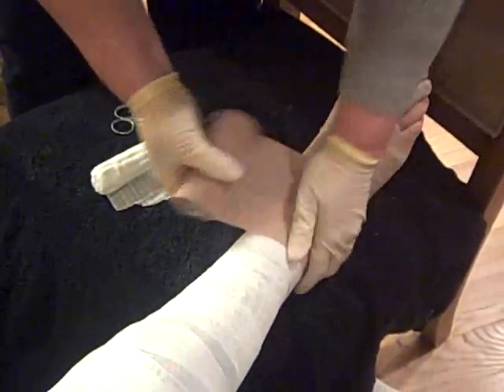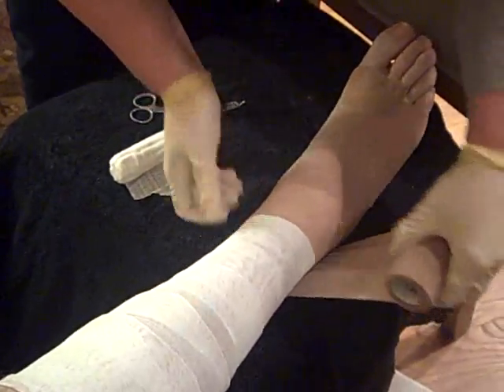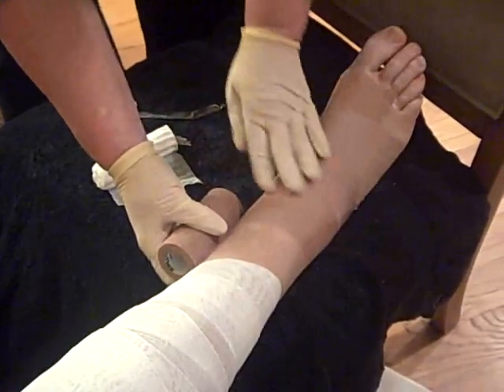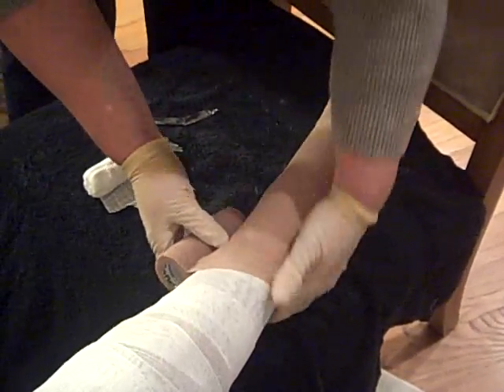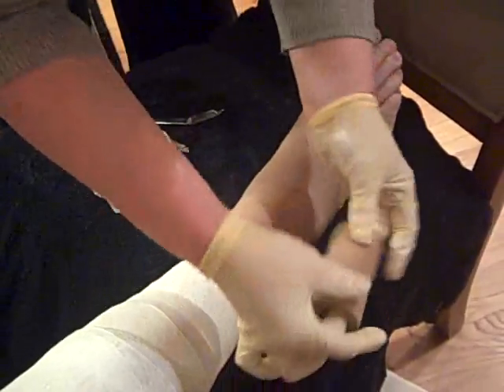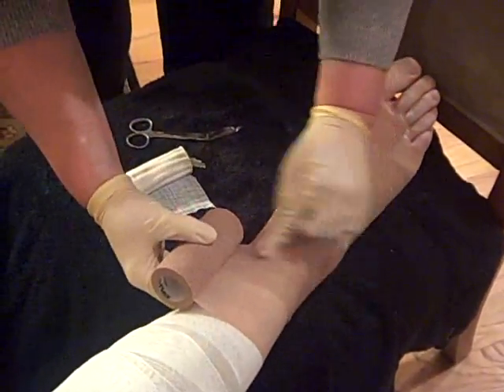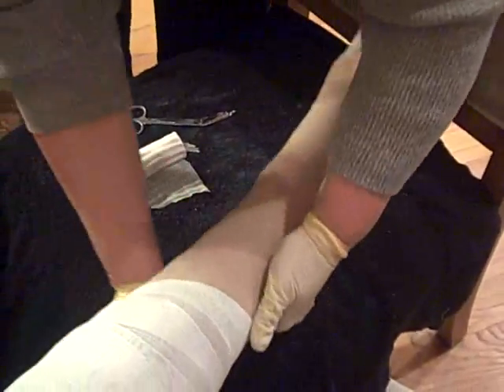Is that a tighter fit when this is going on? Yes, it's a little tighter. Now remember, you want to come 50% over. So you're going to have 50% tension, and you're going to be covering half of the previous wrap. As I come around, when I pull back and release the tension, I'm covering exactly half of where I had covered before.